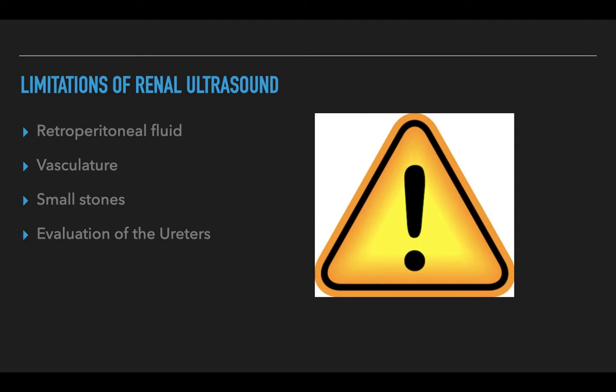And then lastly, when you're evaluating your ureters, ultrasound is definitely not very good for that, and you definitely want to utilize CT scan potentially to better get an evaluation of where a stone may be located because ultrasound is not so great.